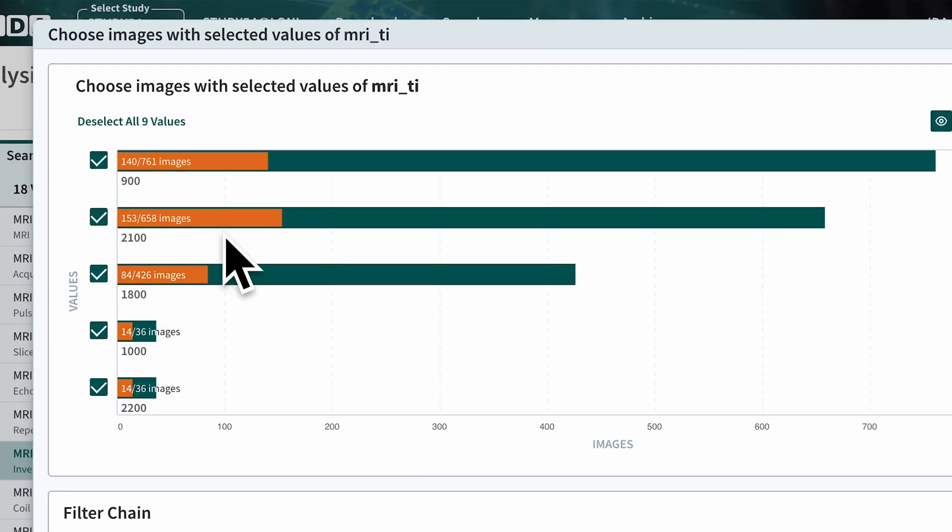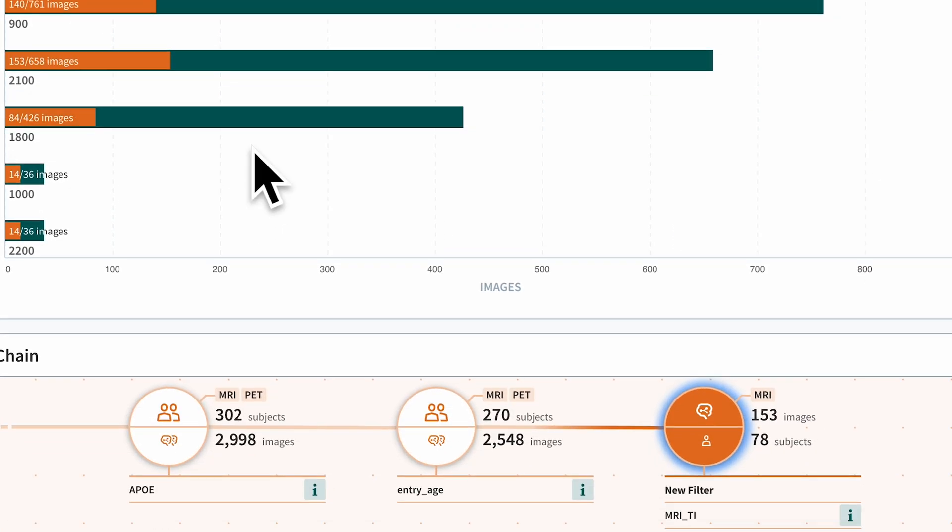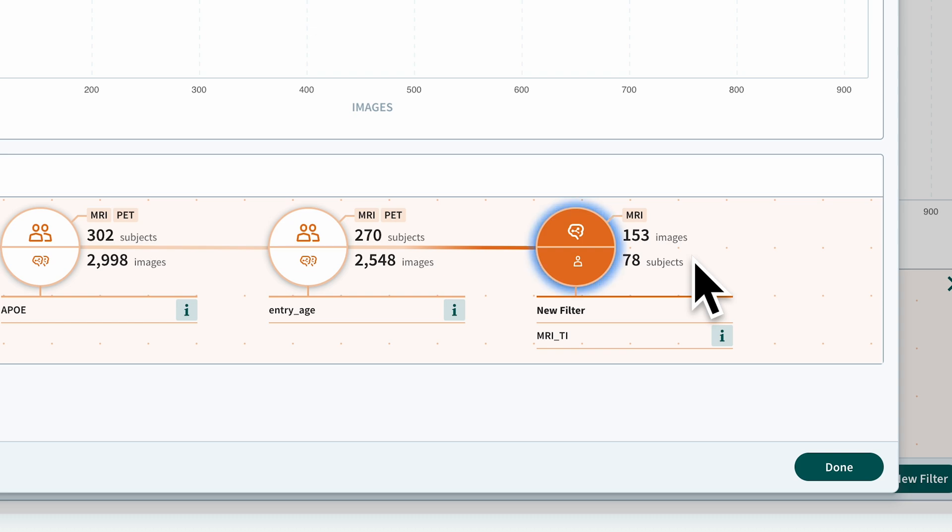Select only the inversion time equal to 2100 milliseconds. As we can see, this reduces the number of scans in the cohort to 153 scans from 78 subjects in our cohort. Create the filter by clicking the Done button at the bottom.